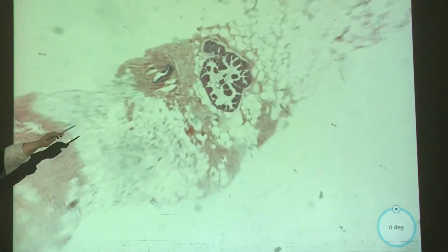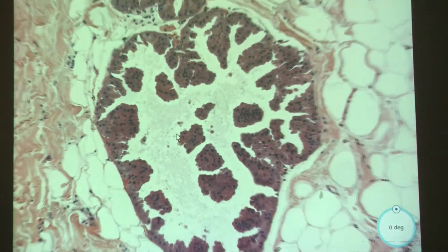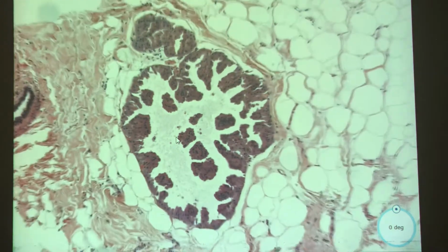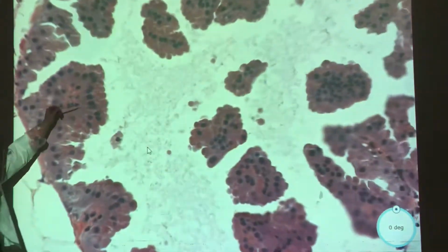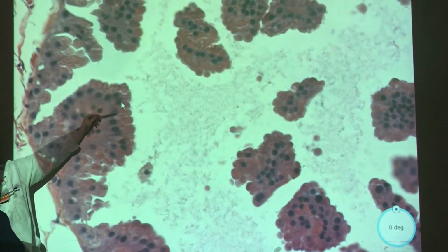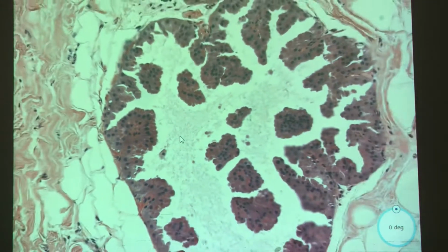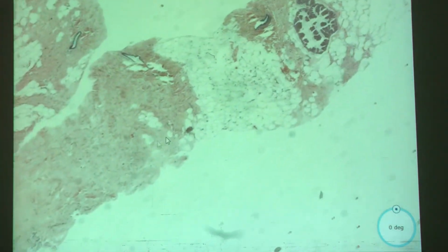Oh, what is that? It's one of the cutest things in breast. I love looking at that. Very pink. It's very pink. Apocrine metaplasia. Perfect. Yes. Kind of falling apart. And actually it looks like it has some Paneth cell-like granules that sometimes you can see with apocrine metaplasia. No one knows what that means, but sometimes you see it, so don't let it freak you out.